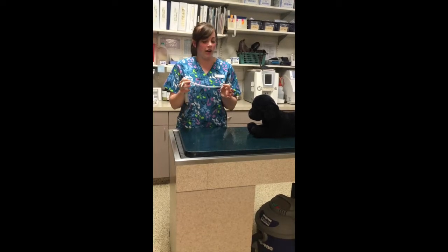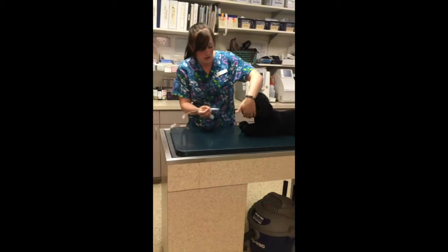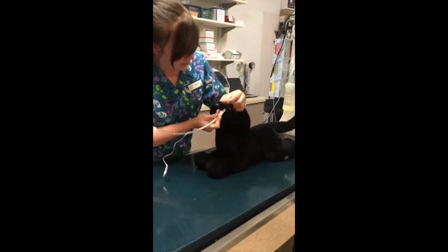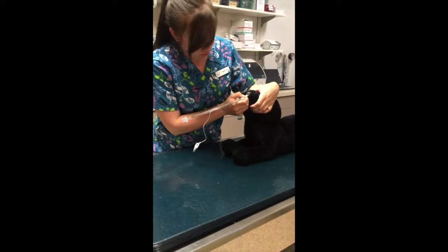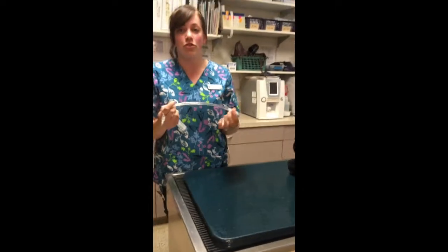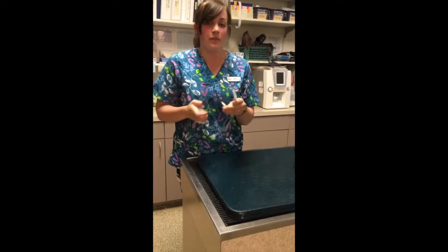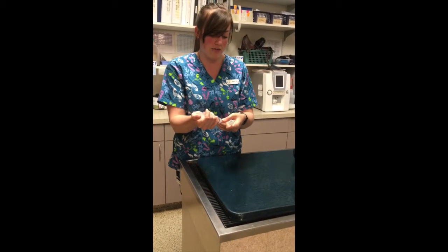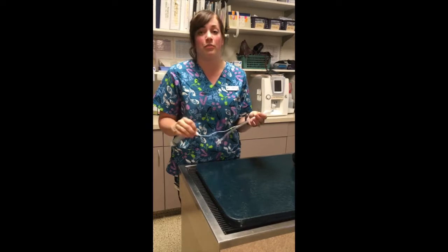Alright, so when you are choosing an endotracheal tube to use, the way you can measure it is you can look at the nose, so the tip of the tube here should fit nicely between the nares of the nose. Once you've chosen your tube, you want to make sure that your tube is not going to leak, so go ahead and take a cuff syringe and inflate your tube. You also want to make sure that you're inflating it to the appropriate amount.